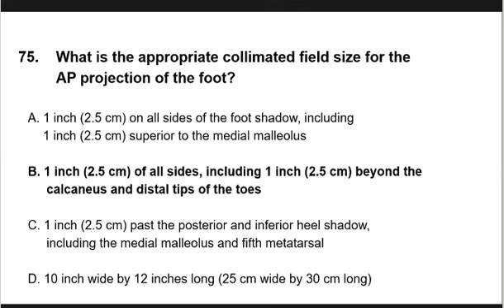So pag sinabi nating 1 inch, that is equivalent to 2.5 cm on all sides and 1 inch beyond the calcaneus and the distal tips of the toes. So that is the collimation and the AP projection of the foot.